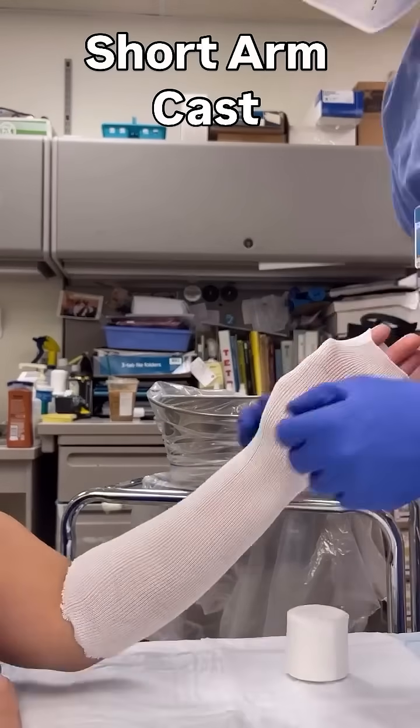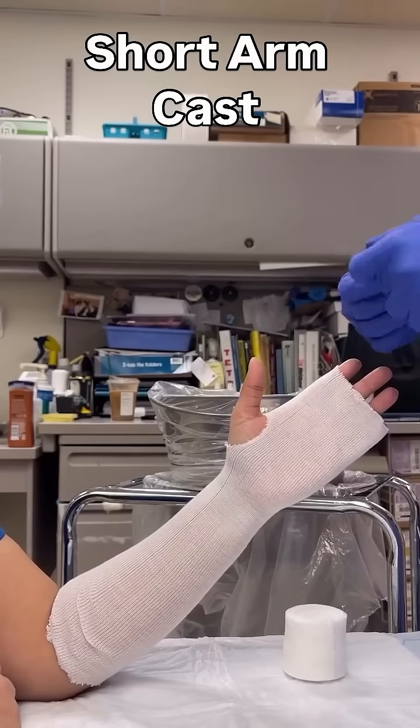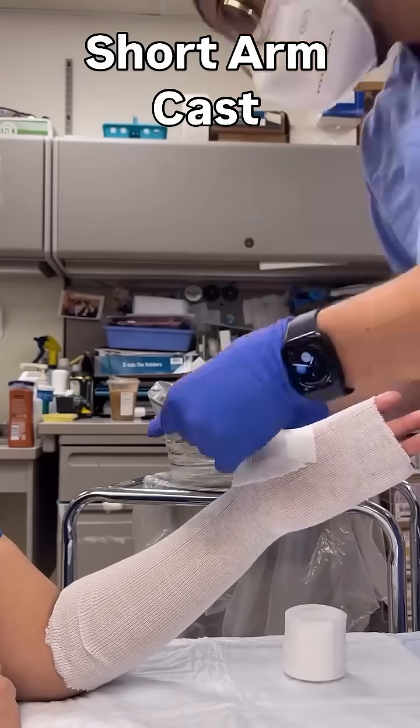Let's go over how to make a short arm cast. We start by placing a stockinette over the forearm and the hand. Make a little hole for the thumb to poke through, then add another strip of stockinette over the thumb to cover the web space. You can place some tape to secure it so it doesn't shift when you're wrapping with the web roll.